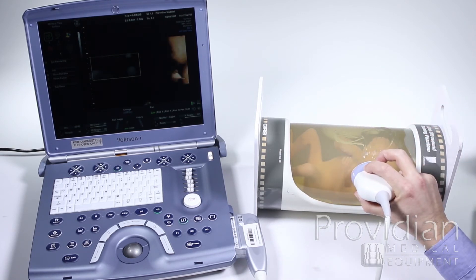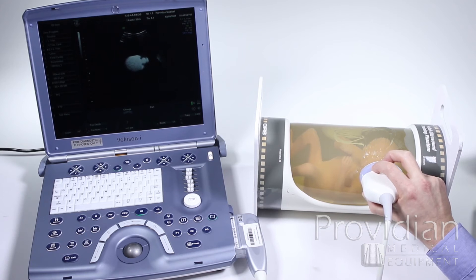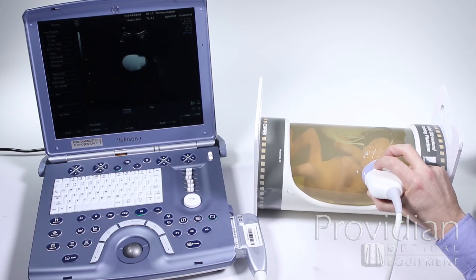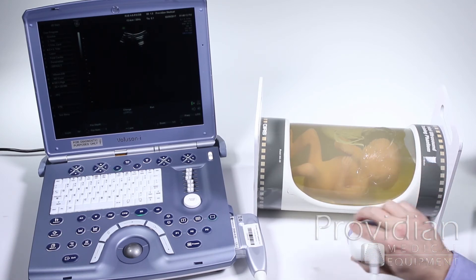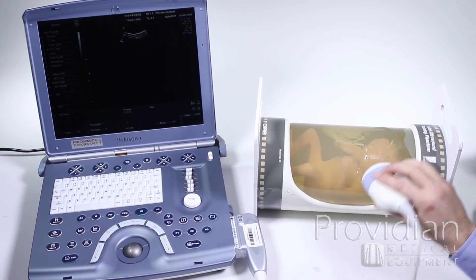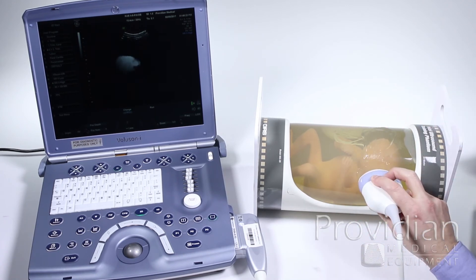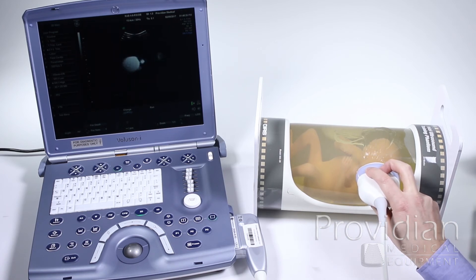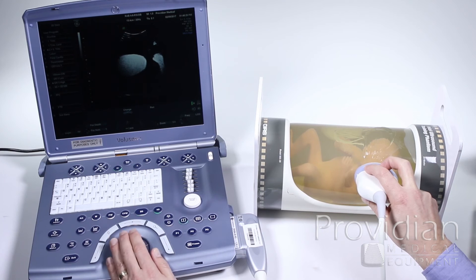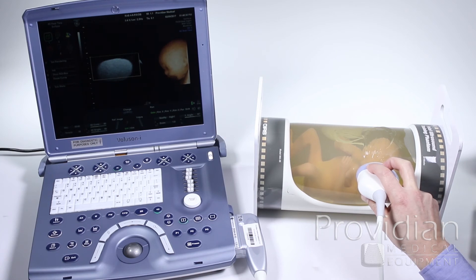When most techs first do 4D, they're used to showing a profile in 2D where you would see the orbits of the eyes — it looks like the baby is looking out. But what the 2D is doing is just taking a slice right across the top of the face, showing you the orbits as if you cut right through there. So when they go to 4D thinking that's the look they want, they can't figure out why the image is terrible — because now it's rendering the side of the baby's face instead.